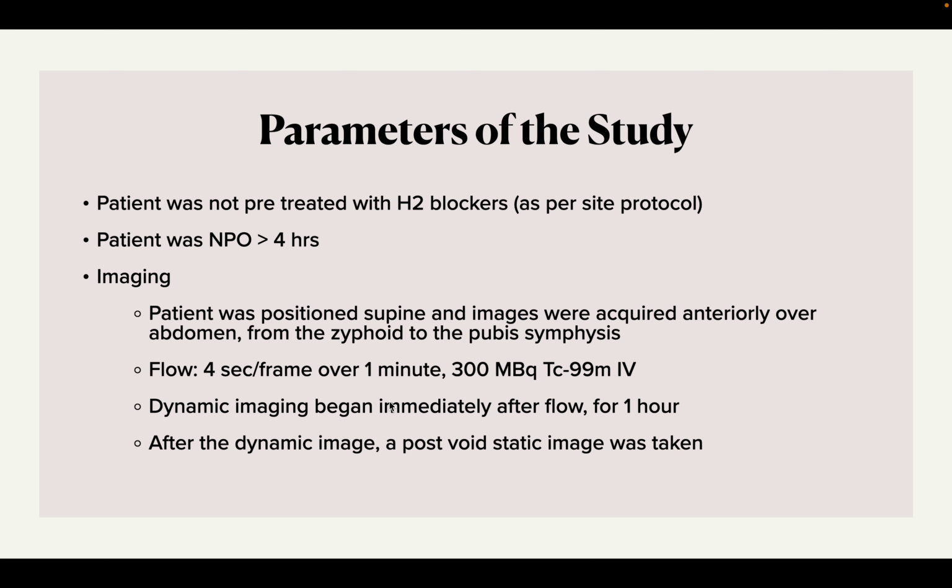After we positioned her, we did a flow, 4 seconds per frame over 1 minute, and we injected 300 megabecquerels of pertechnetate IV. After that flow, we did the dynamic imaging for 1 hour, and then a post-void static image after that.